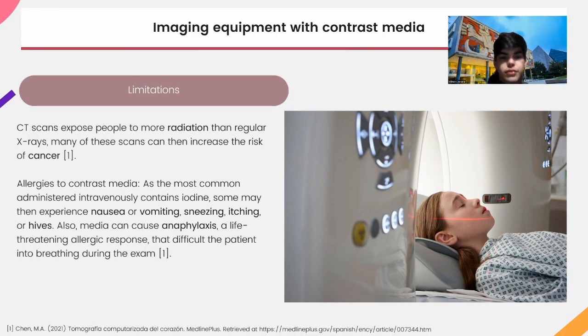As for limitations, for CT scan, patients are exposed to radiation from X-rays, and this can cause cancer. Also, contrast media can cause allergies, for example nausea, vomiting, and also anaphylaxis attack.